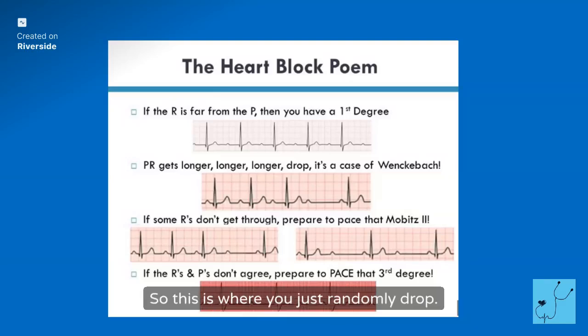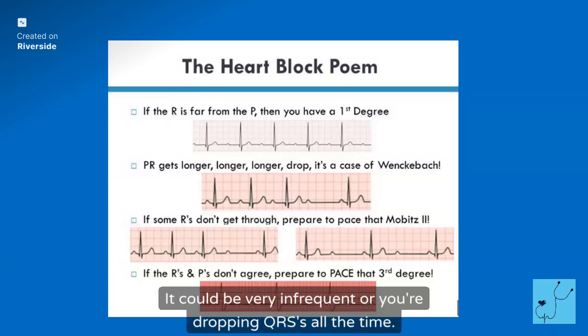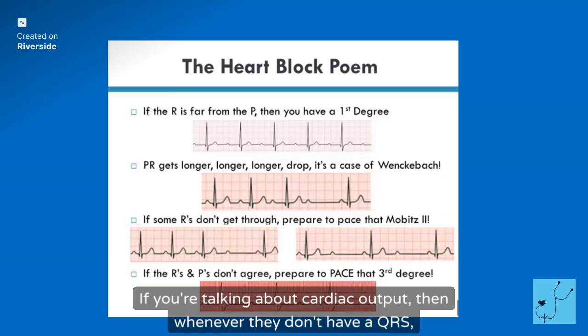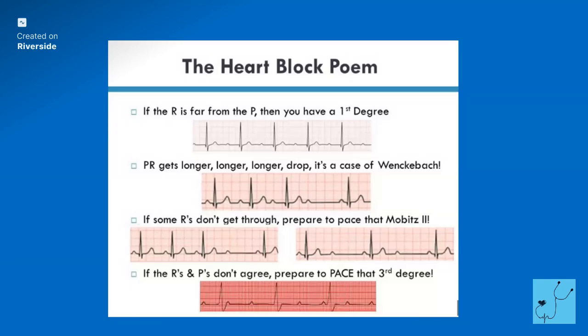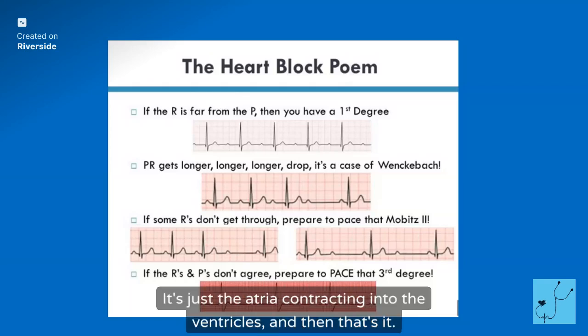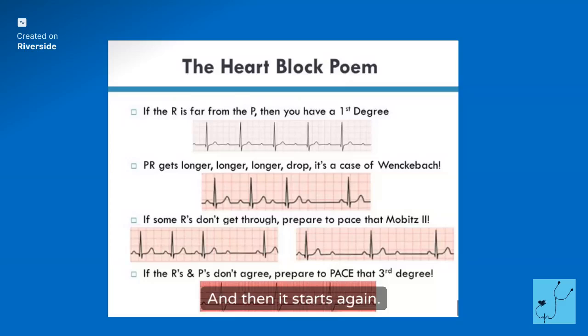So this is where you just randomly drop, and it could be in a pattern or not. It could be very infrequent, or you're dropping QRSs all the time. Now, this could be a problem. If you're talking about cardiac output, then whenever they don't have a QRS, you're not getting any blood flow to the body during that beat because it's not contracting. It's just the atria contracting into the ventricles, and then that's it. And then it starts again. So this could be a problem.